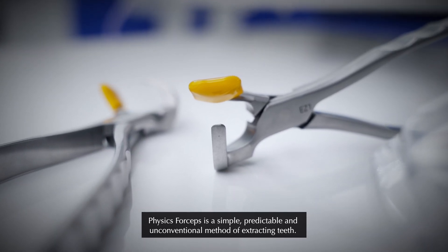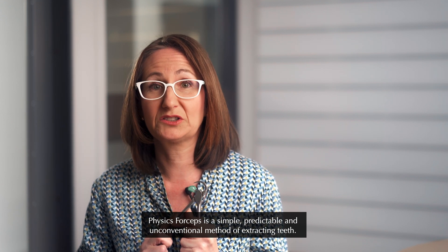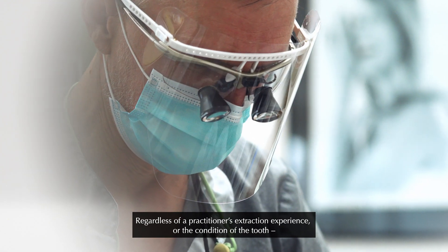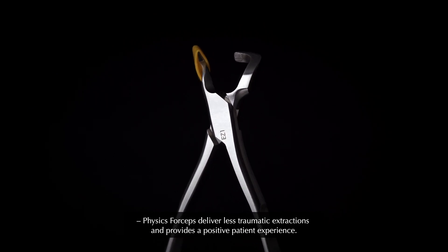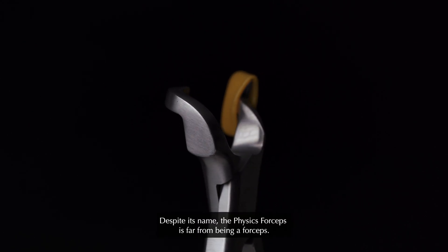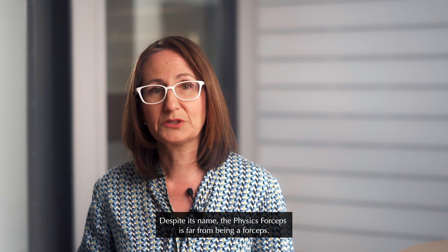Physics forceps is a simple, predictable and unconventional method of extracting teeth. Regardless of a practitioner's extraction experience or the condition of the tooth, physics forceps delivers less traumatic extractions and provides a positive patient experience. Despite its name, the physics forceps is far from being a forceps.